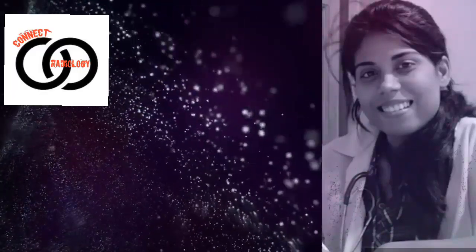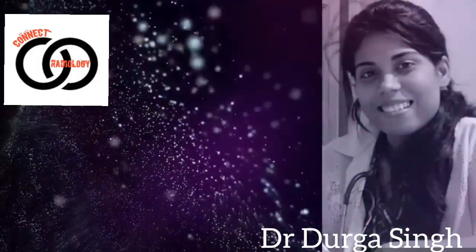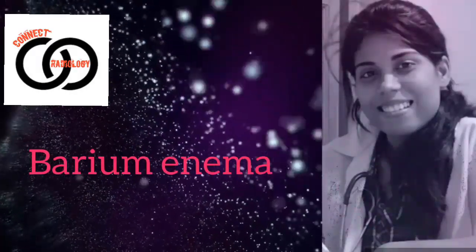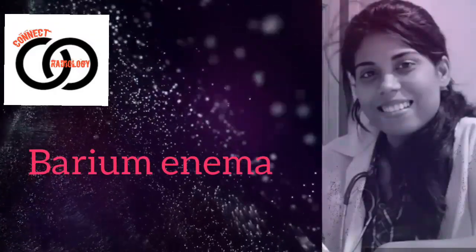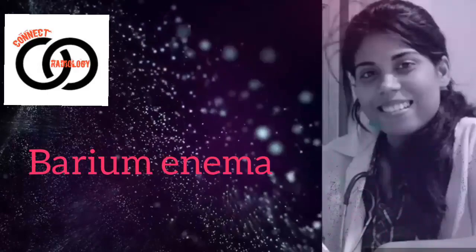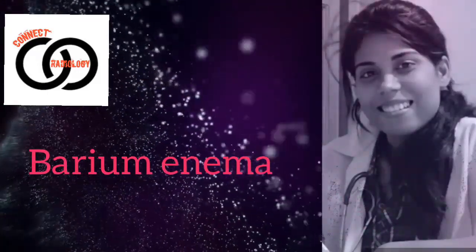I'm Dr. Durga Singh and we are into the last segment of barium studies, that is barium enema. This is important as well as confusing as it can diagnose a vast majority of colon pathology. It is also one of the higher topics from exam point of view. So let's proceed further.